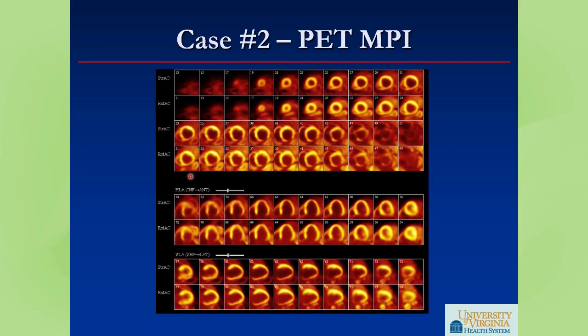We could potentially say the patient had peri-infarct ischemia, but I think that the amount of ischemia here is a little more than that. I try to reserve peri-infarct ischemia for when I'm talking about just a little bit of ischemia nipping at the edges of an infarct. And this really seems to me to have two distinct components to it.